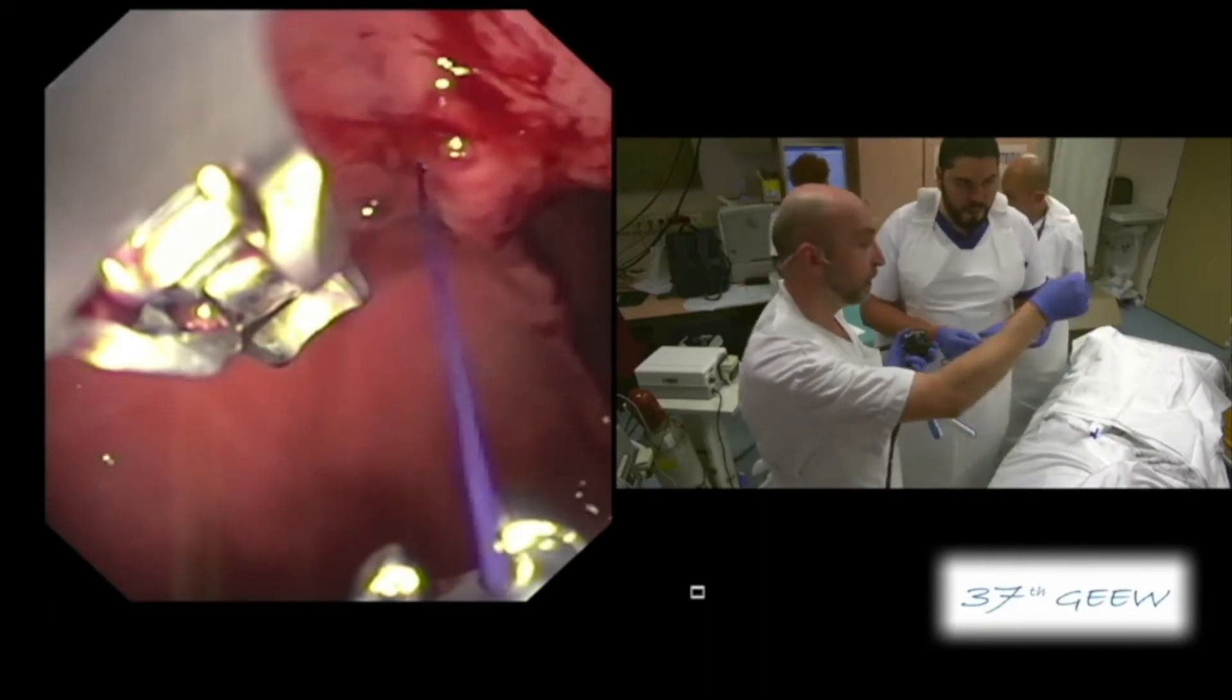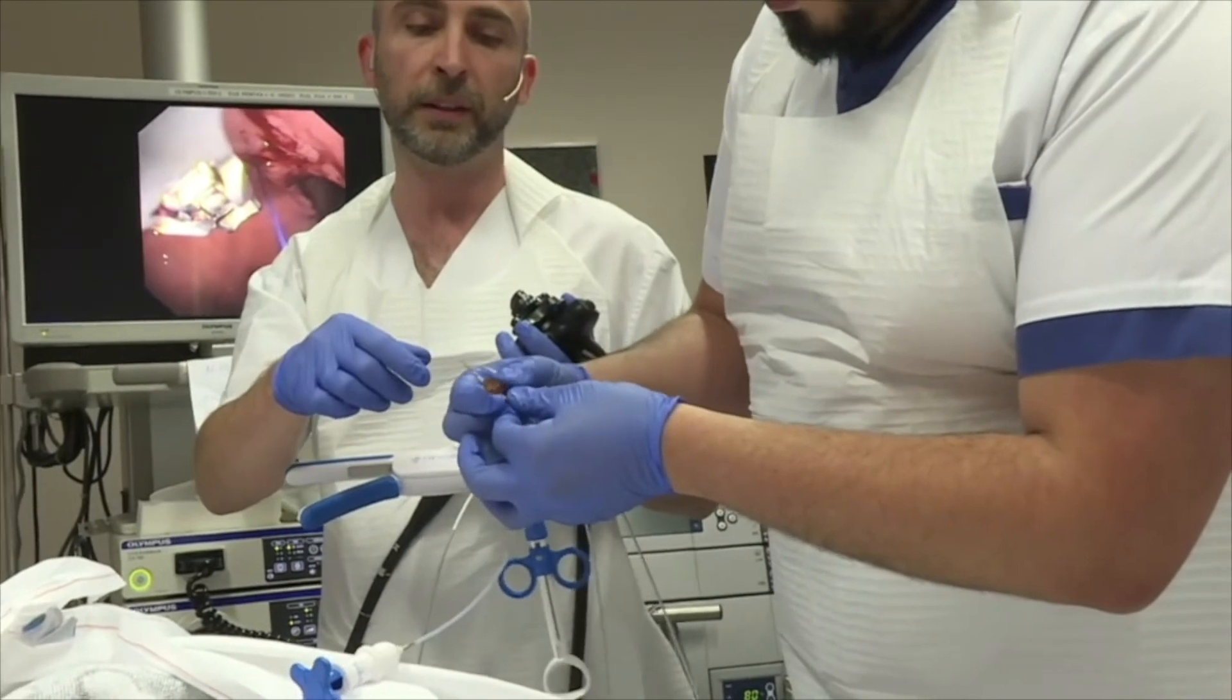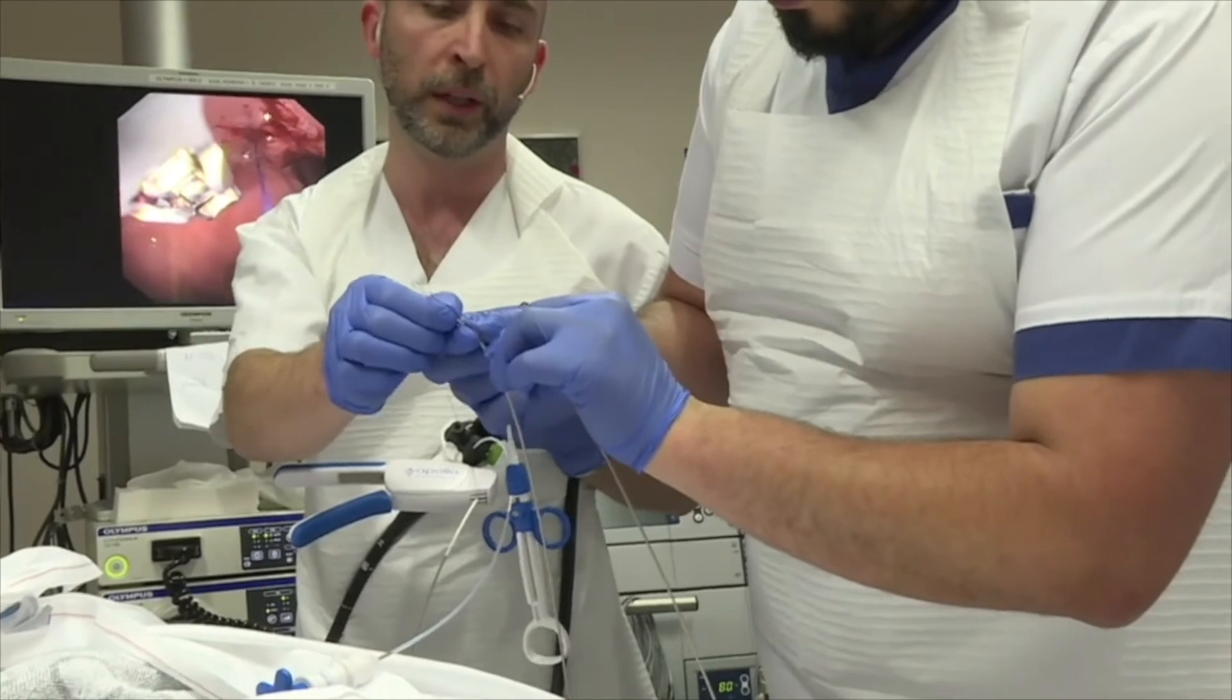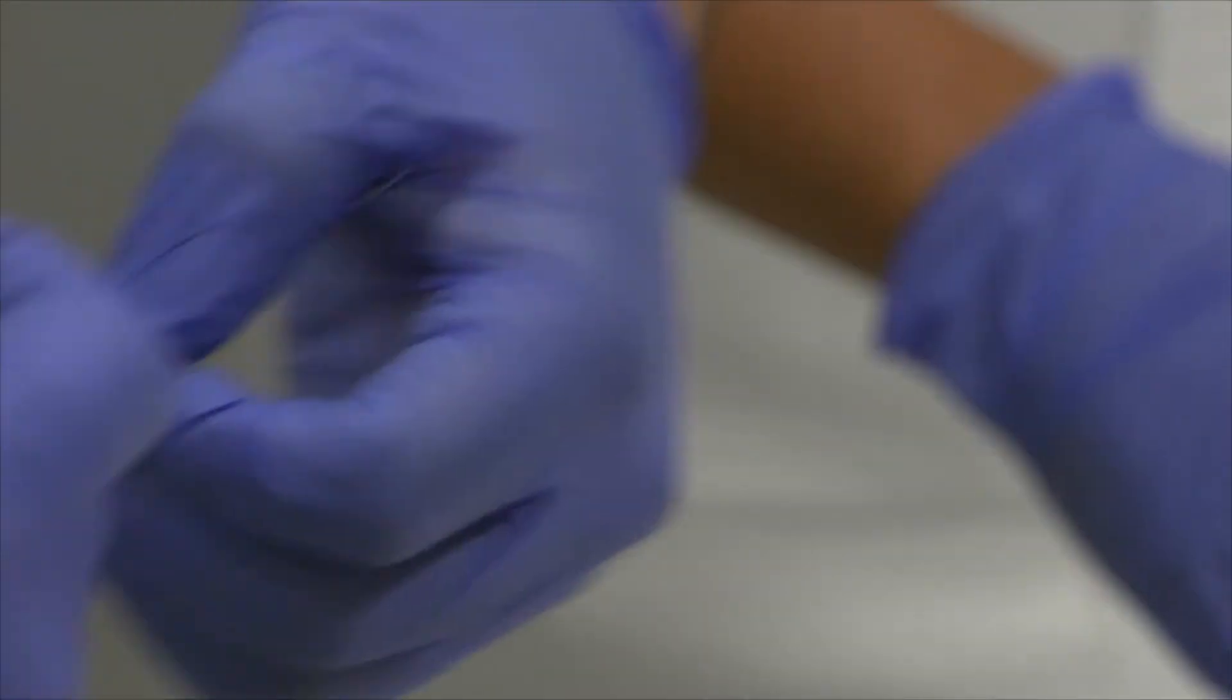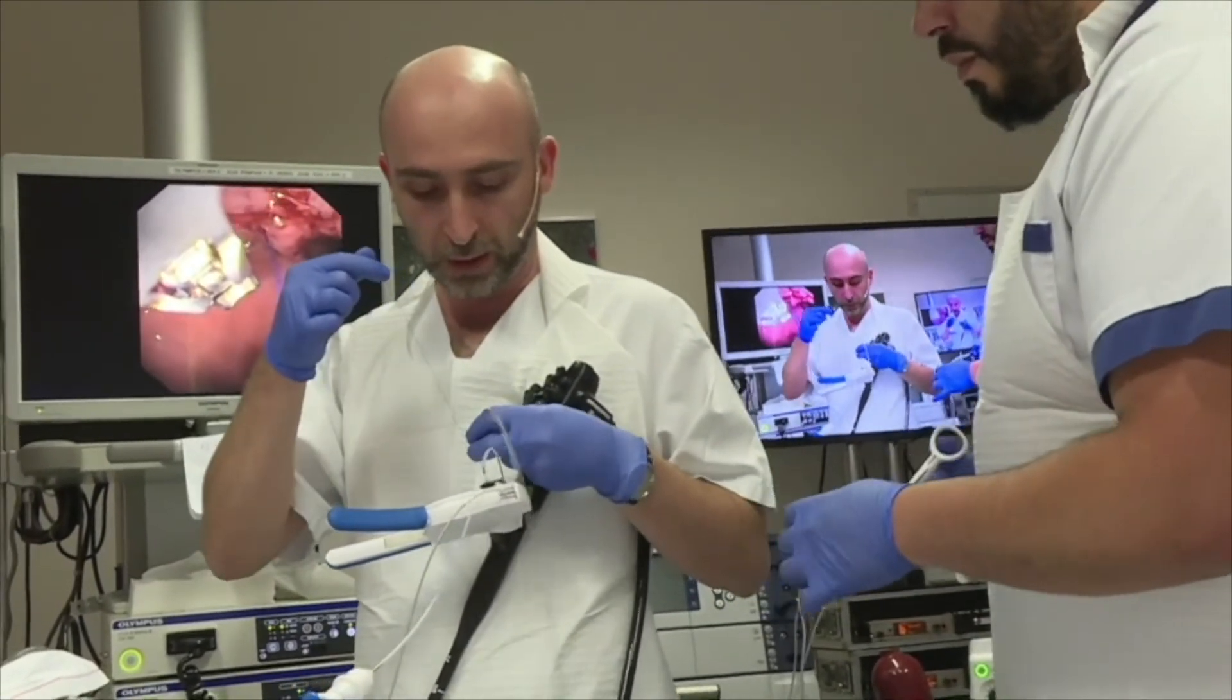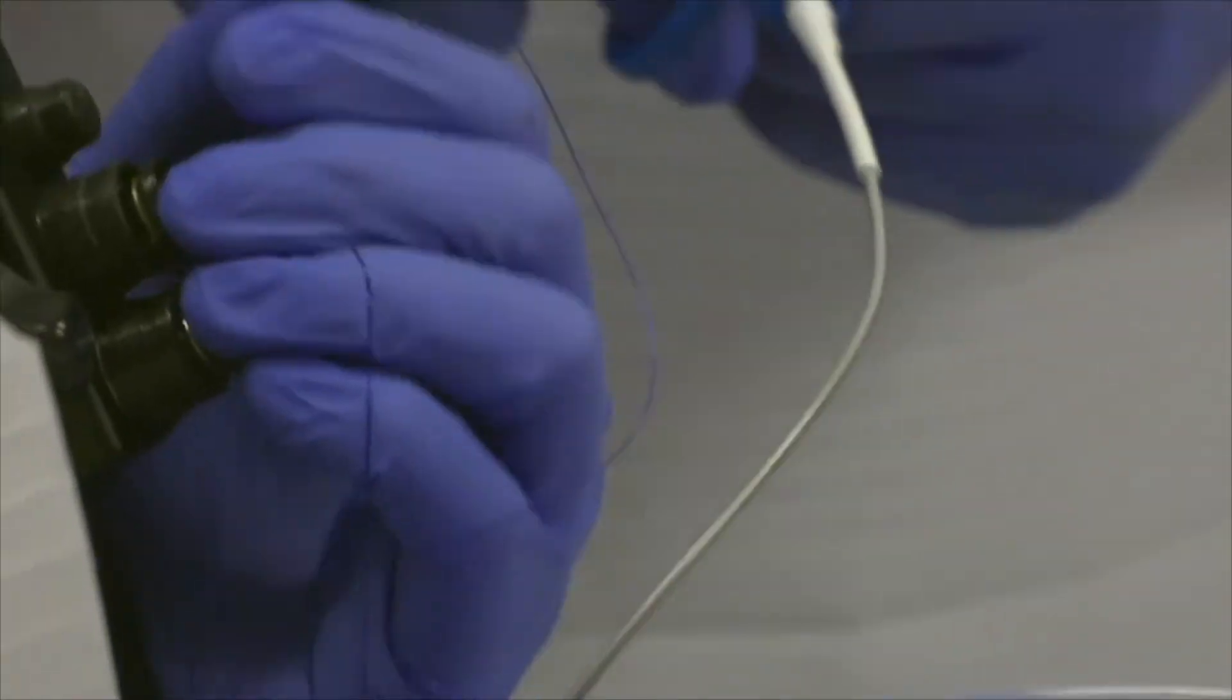Now I will press the blue button. Needle fold down. Mustapha will reload. And now we will cinch. You see he is placing the stitch in the cinching device. You just hold this. Pull slowly, slowly. Excellent. Continue. And now the secret here is to pull only as much as needed and not to pull too much. I hack the scope, I do this by myself. Left hand I keep the stitches and with the right I am pushing the cinch. We are there.